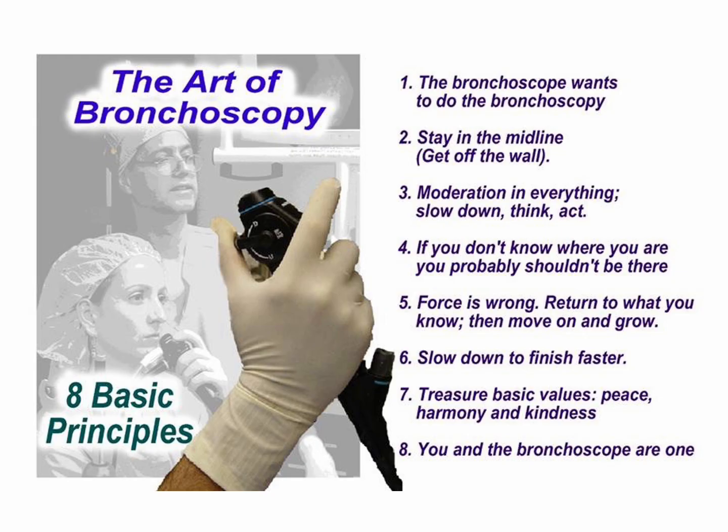No single technical maneuver guarantees success. Rather, consistent attention to preparation, patient comfort, procedural efficiency, and sound judgment allows clinicians to maximize diagnostic yield while minimizing patient risk. In subsequent modules, we will examine procedural technique and complication management in greater practical detail.